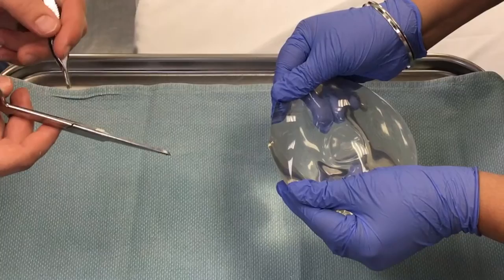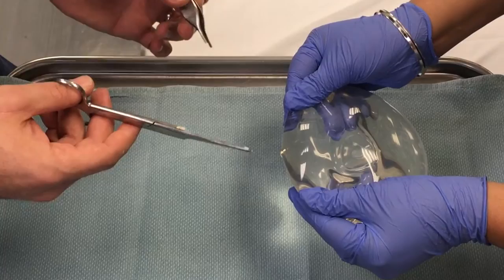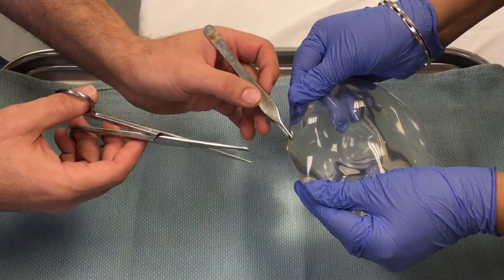Now we're going to cut out a little wedge from the implant to show that the silicone, when left alone, will stay cohesive and nice and tight within the implant.